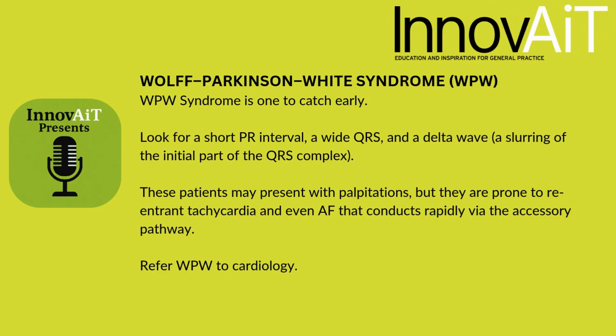These patients might present with palpitation, but the danger is they are prone to reentrant tachycardia and even AF. It might conduct rapidly via the accessory pathway. Refer WPW to cardiology.